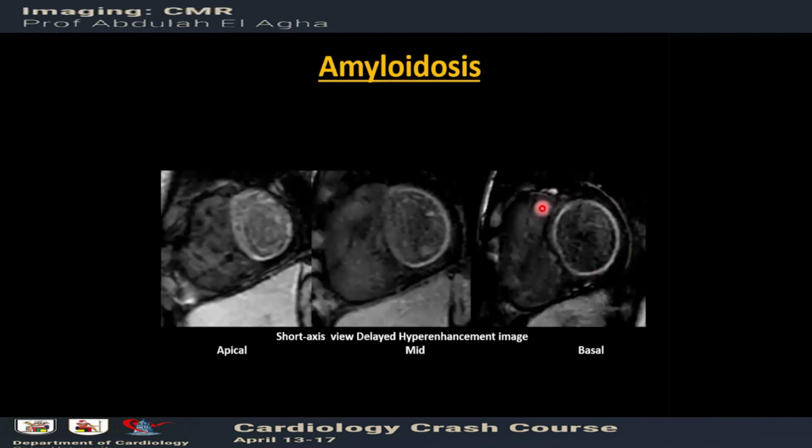This is the short axis, as you see. This is not a subendocardial scar of ischemia, because it's not the whole territory that is occluded. This is the amyloidosis spot diagnosis. And there's another sign: we do a sequence called the Look-Locker. But because of the time, I cannot put all the slides, the difficulty being to nullify the signal in the Look-Locker, okay?